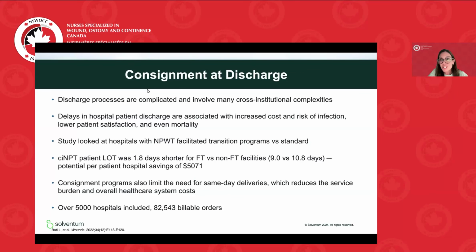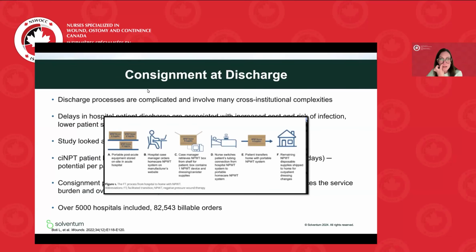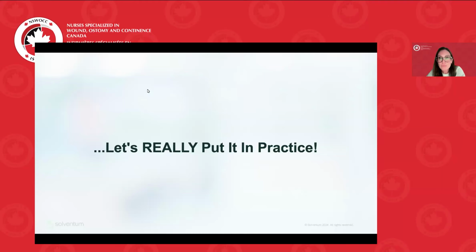With that, I do want to mention that one of the ways that we've been able to consolidate our coordination, especially in the discharge from the inpatient to the post-acute or outpatient setting, is the consignment at discharge, which is where essentially you have the negative pressure available to you on the inpatient side. Patient has their dressing on, you just simply unhook, hook to the portable or the ActiVac, and then they're able to go home from there. If you're not familiar with that, there are actually studies behind that as well, showing decreased length of stay, improved patient satisfaction, and making sure that we're really coordinating their care well.